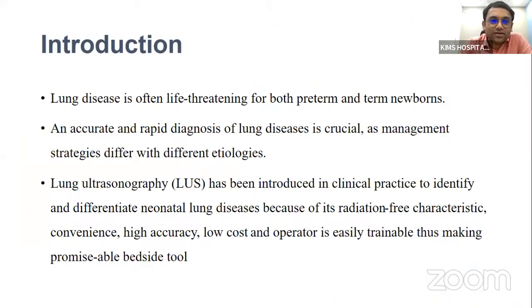As we know, lung disorders are one of the most common causes of problems in the newborn period, and most of them may be life-threatening for both term and preterm newborns. We need an accurate and rapid diagnosis of lung disease because the diagnosis of each disease will lead to specific management of the condition, so we can have diagnosis-based management of each condition. For this purpose, we have the X-ray. We have been using X-rays for a predominant period of time, and majority of newborns are managed predominantly based on X-rays.